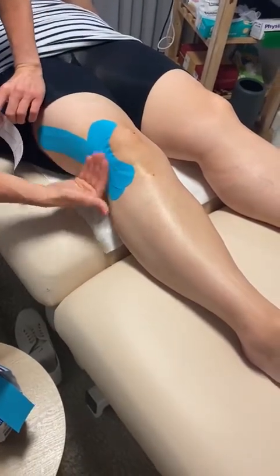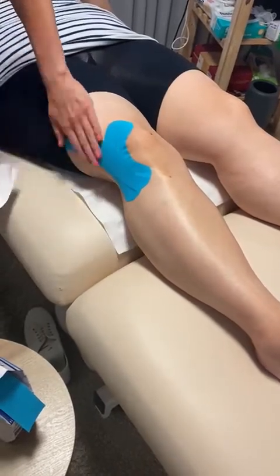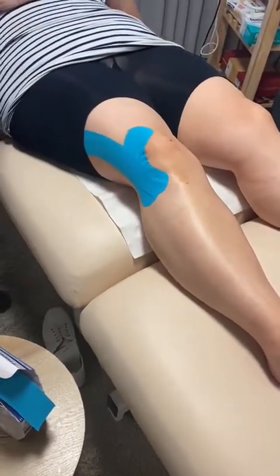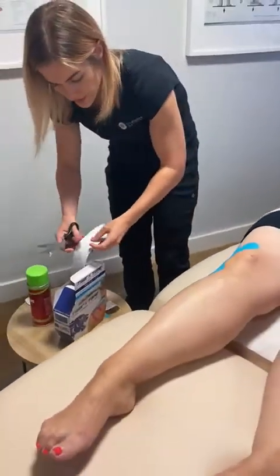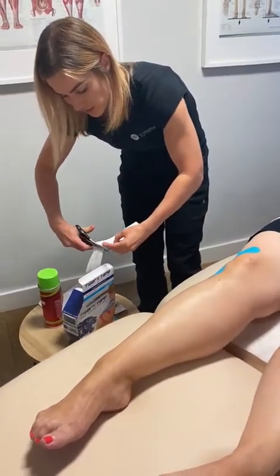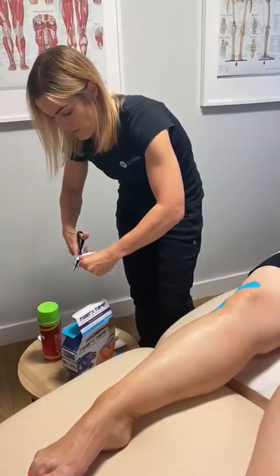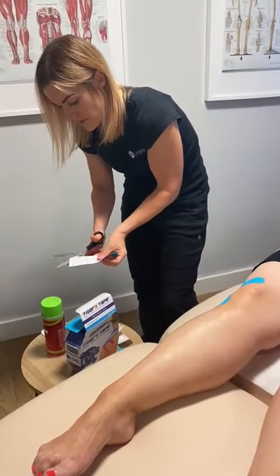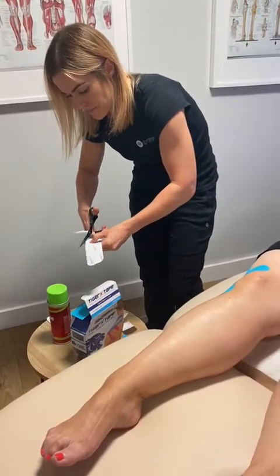So again, depending on how tall you are, you might want to do a sort of slightly longer length, okay? So either we can leave it at that, or we can just do one more strip over the top, which I'm going to do in this case. So again, I'm going to use a 3, okay? Cut that around the edges. Okay, and we're just going to go over the top of what's already there.